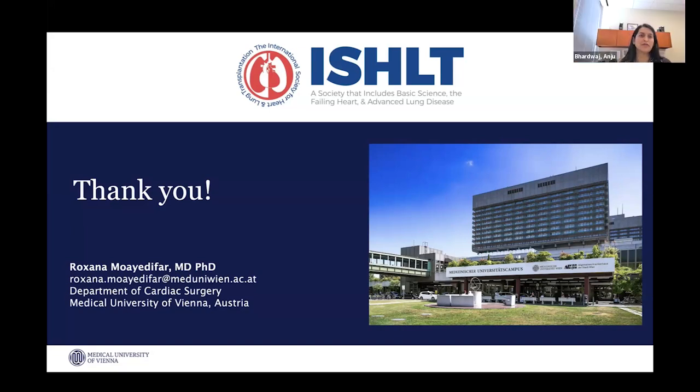Now this question could be open to everyone, but in such a case, would you recommend any kind of dual antiplatelet? Sorry, not even dual, because nowadays with HeartMate 3 we're okay after the ARIES trial. But do you add any aspirin to it? Is there any benefit, considering that this is all a fenestration issue, of another extra antiplatelet agent? I have to say we don't do it. We go with just Marcoumar or warfarin. I don't know if anybody else has any other experience, but this is our protocol.